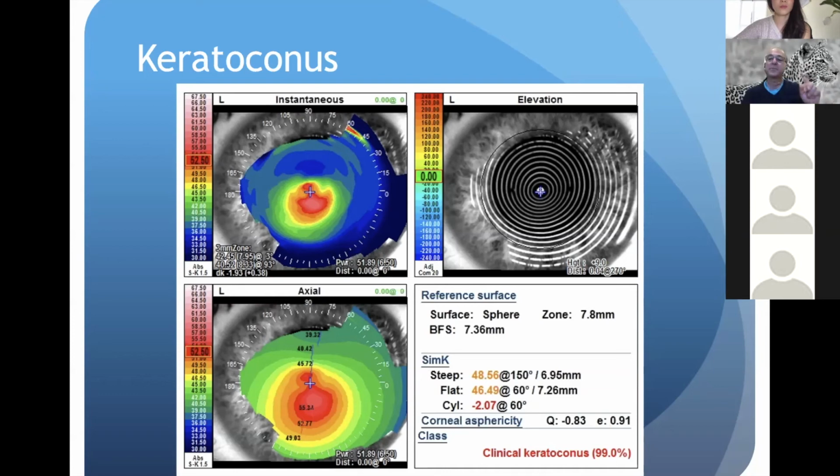I once heard Jay Kratchmer talking at an EBA luncheon. And he says whenever he goes in to see a patient and he knows they've got keratoconus, he'll pick up the chart before he goes in and he'll see that the vision has been recorded at 20/30. He looks at the topography and the patient has obvious keratoconus. And he knows that the person who took the vision spent too much time getting the patient's vision, because keratoconic patients have a multifocal cornea, and often their superior cornea is pretty normal.